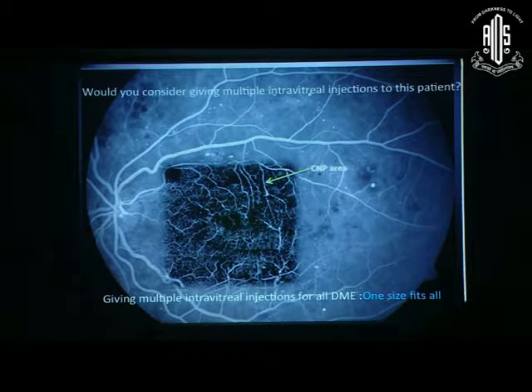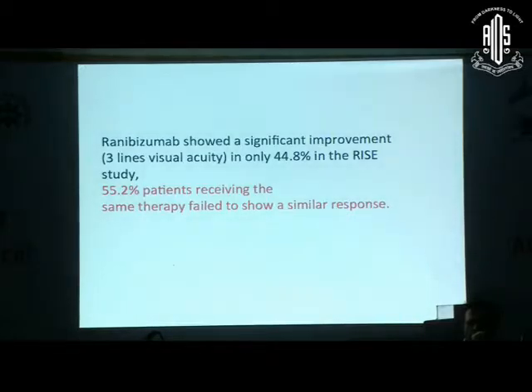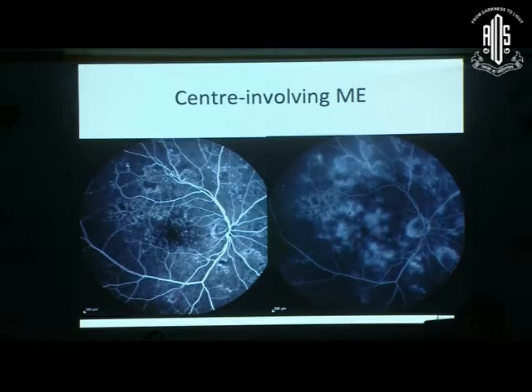So when we are talking about angio-OCT, we are too new right now to base our decisions on this, but yes, it does show more of these dark areas of capillary non-perfusion, and you have to decide how to manage them. So when we come to diabetic macular edema now, we all heard that ranibizumab is the thing. And when we are talking about center involving macular edema, we do realize injections are the treatment.